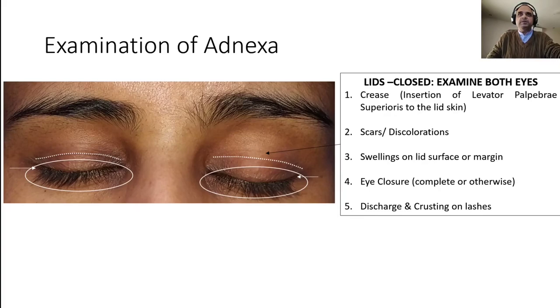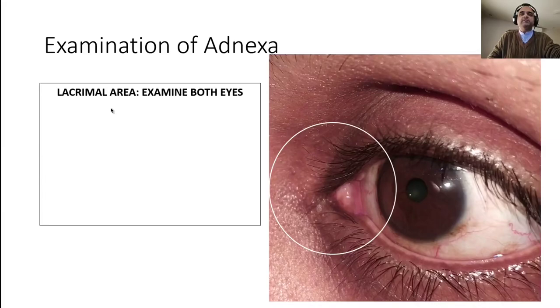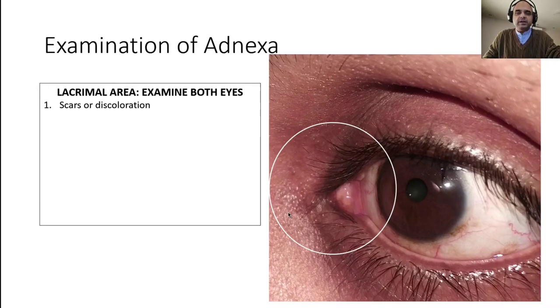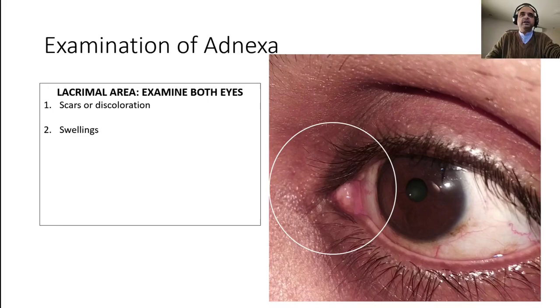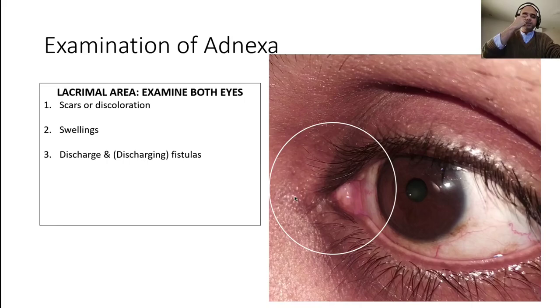Now we examine the lacrimal area, where the tears drain away from the eye. Look for scars or discoloration — scars indicate trauma or surgery, discoloration indicates prior healed scars. Also look for swellings, which in this area are most commonly due to the lacrimal sac. In South Asia, lacrimal sac swellings are common, which we'll cover when we do the nasolacrimal system. So watch for swellings in this area, as well as discharge and discharging fistulae.